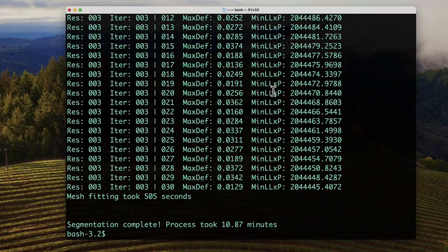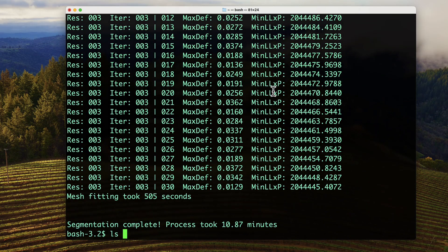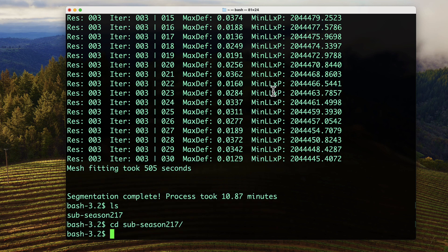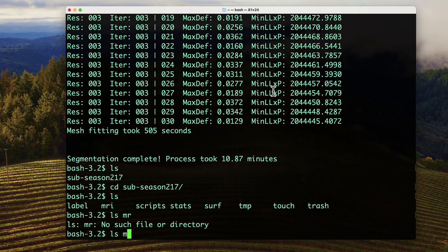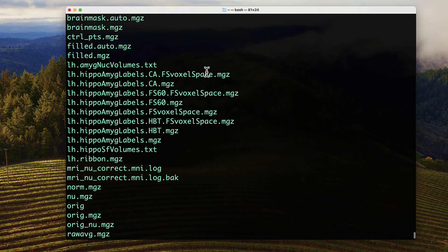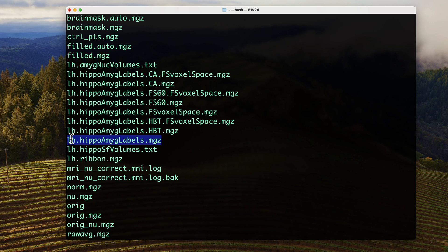Once it finishes, you can find the results in the MRI directory. The volume with the most complete labeling scheme is lh.hippoAmygLabels.mgz. The meaning of the other suffixes can be found in the link down below.